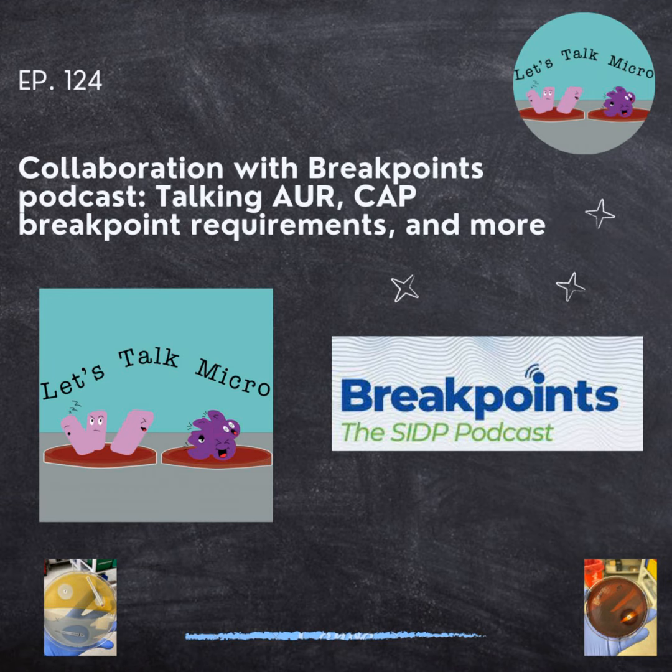What is the change in the breakpoint interpretation? So the next step in this particular case, using our automated method, is to ask what is the range of dilution that you have for that organism? Is your platform able to cover the new interpretation? There is a typical traditional case with cefazolin in some of the Vitek cards where the minimal dilution was 4. Exactly. So the minimal dilution was 4. So if you have a breakpoint now that goes to 2, you know that your method will have a limitation in that particular scenario. So it's okay for urine isolates, but not for non-urine. So this is the type of limitation that the laboratory has to identify.